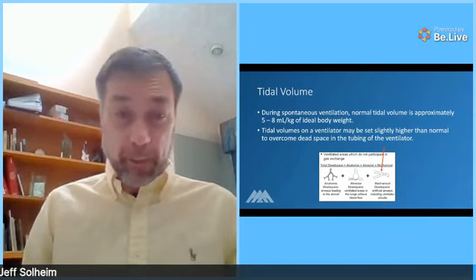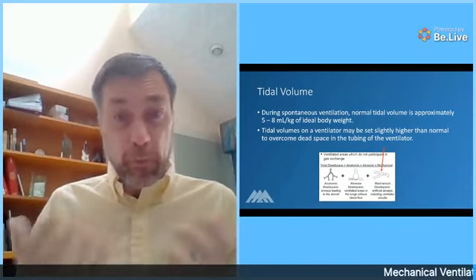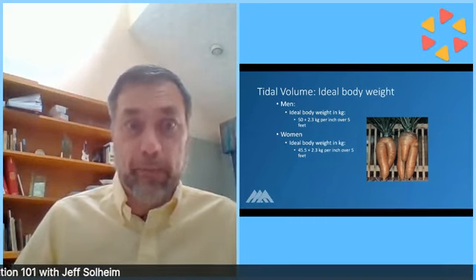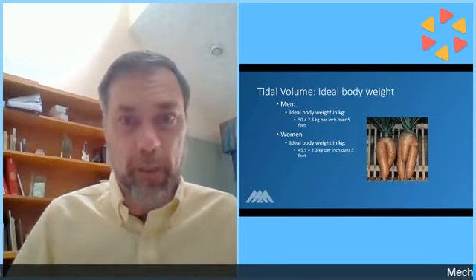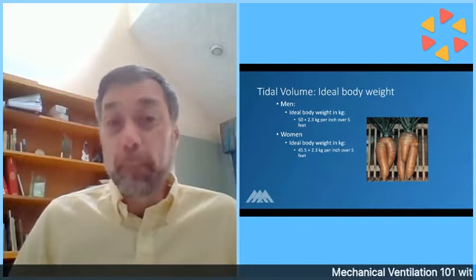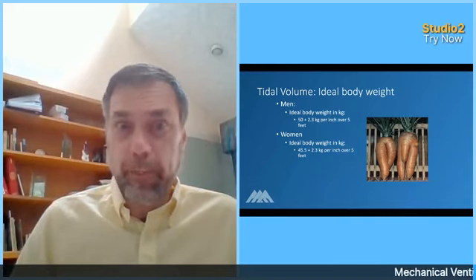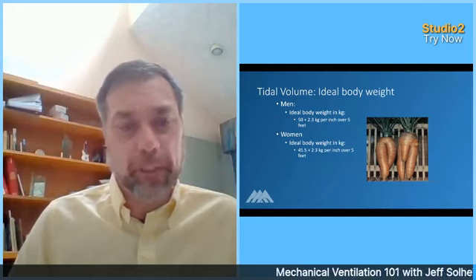You probably don't need these, but just so you know what our RTs are doing when they're figuring out tidal volume, if we advance the slide, you can see how we set tidal volumes. Again, there's apps that do this, and we can often do this in our head when you intubate as much as some people do. I mean, as a flight nurse, I'm intubating all the time. So these are things you can do in your head, but you can also calculate to figure out a tidal volume. So in men and women, you can see on the screen the calculation that you can plug into your phone or whatever you're using to figure out what the tidal volume would be for a patient.